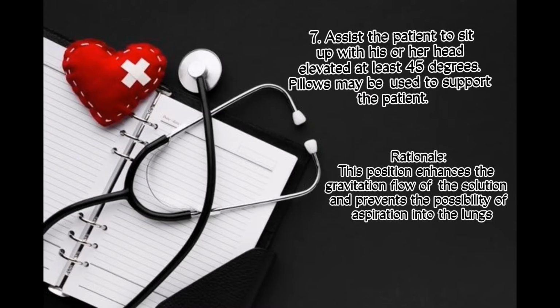The next procedure is to assist the patient to sit up with his or her head elevated at least 45 degrees. Pillows may be used to support the patient. This position enhances the gravitational flow of the solution and prevents the possibility of aspiration into the lungs.